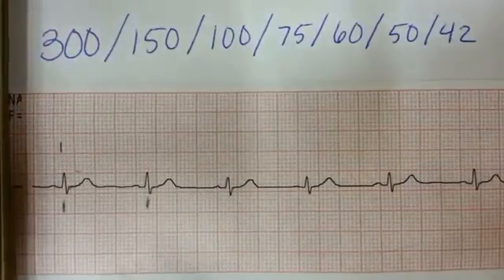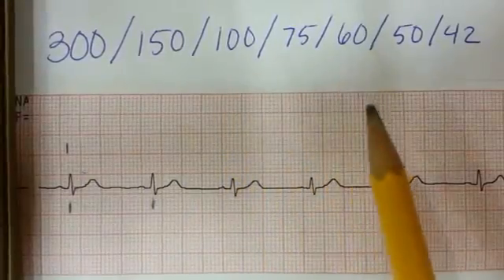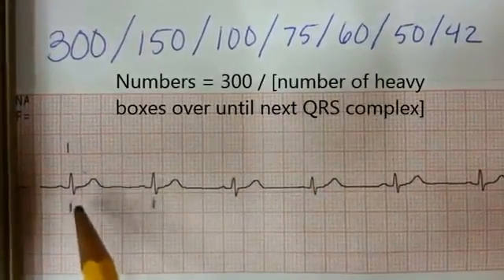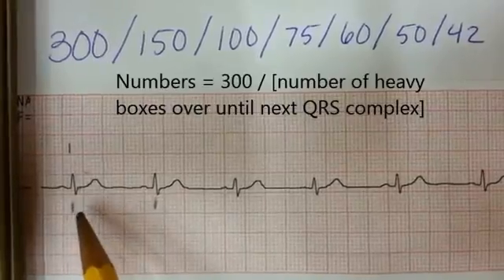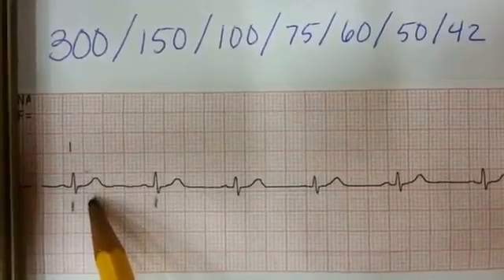So now how do we figure out the heart rate? Well, using this 300, 150, 100, 75, 60, 50, 42 method, we can notice that the space between this mark — then we go exactly five little boxes over, so halfway between those solid lines again.